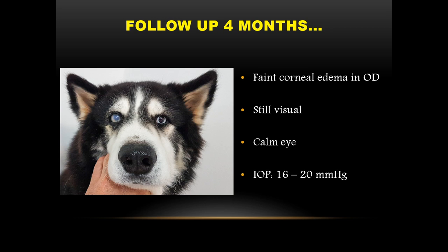The red laser only reacts with tissue with pigment. So the cornea is transparent, so there's no reaction with the laser, okay?